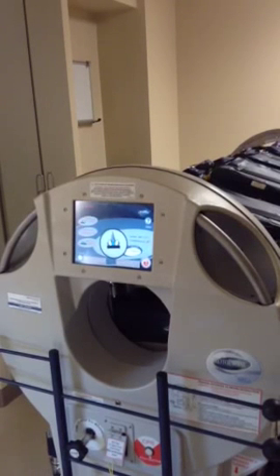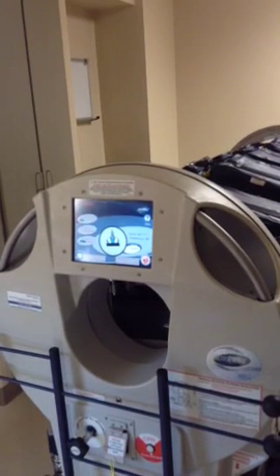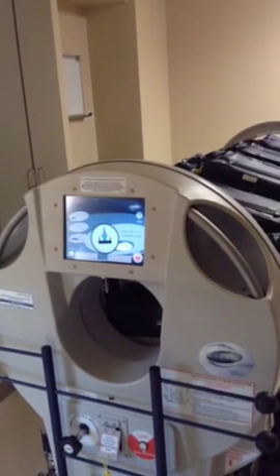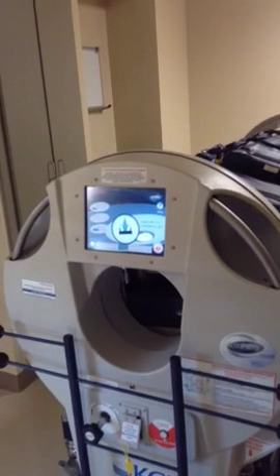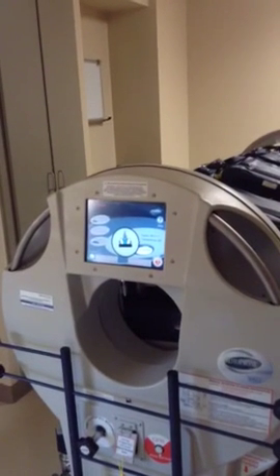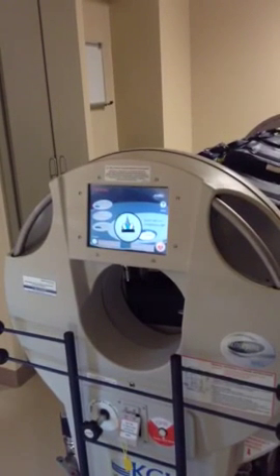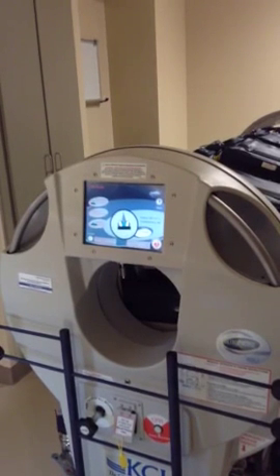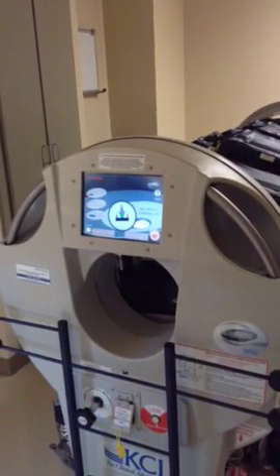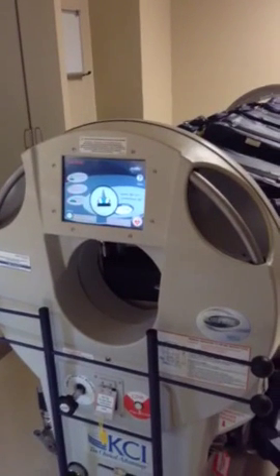She said, I've got to tell you, our outcomes are decent, but when we have a patient code, sometimes it takes us 5 minutes to turn the patient over because it takes 6 to 8 people to turn the patient. They don't have a tube management system, so you have to be able to manage all those tubes. It's easy if it's a kiddo. That's why they do it all the time in pediatric patients. You can just flip a kid, but an adult with all those lines hooked up to CVVHD, CRRT, whatever, with all that stuff, it's scary.